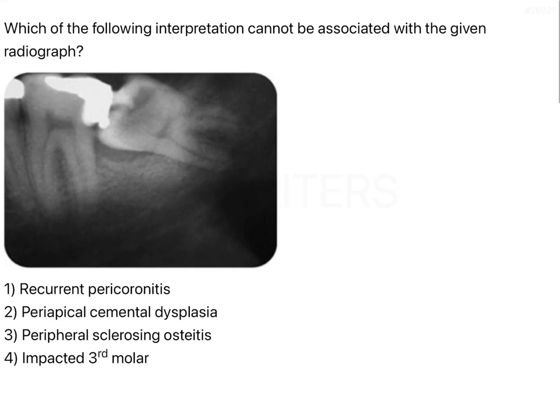Looking at the features in this radiograph: number one, you can see it is probably a third molar, positioned almost horizontally with the roots pointing towards the ramus. It is a mandibular molar — bi-rooted, which confirms it is a mandibular tooth. There is also a radiolucency just below the crown. Given the options, we can identify for sure that this is an impacted tooth.